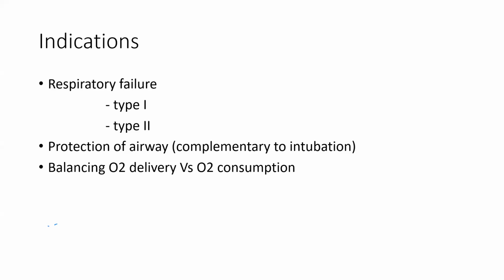You need to protect the airway whenever it is compromised, like in trauma, coma, anesthesia, inhalational injury, corrosive swallowing. So at this point, your goal is not actually to ventilate the patient, it is to protect the airway through an endotracheal tube. And mechanical ventilation comes as an essential association with intubation then. So this is the second very common category of indications for mechanical ventilation.